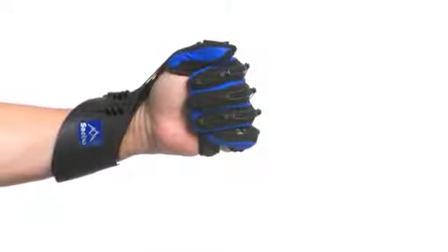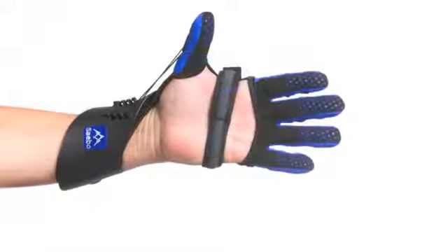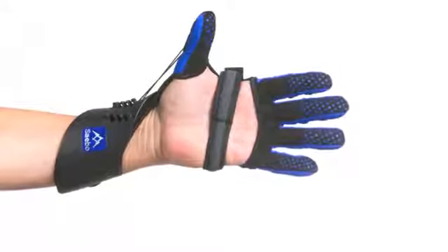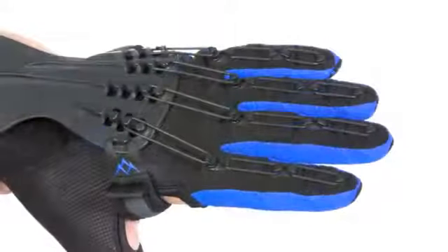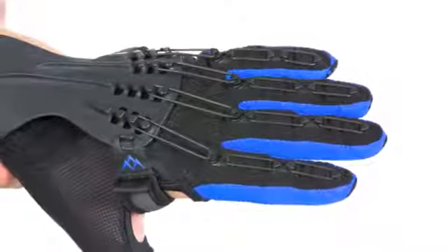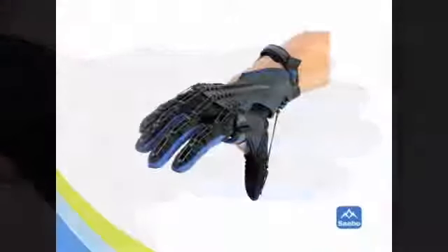The proprietary tension system extends the fingers and thumb following grasping so clients can engage their affected limb for task-specific training. This newfound freedom leads to improved motor recovery and functional independence.